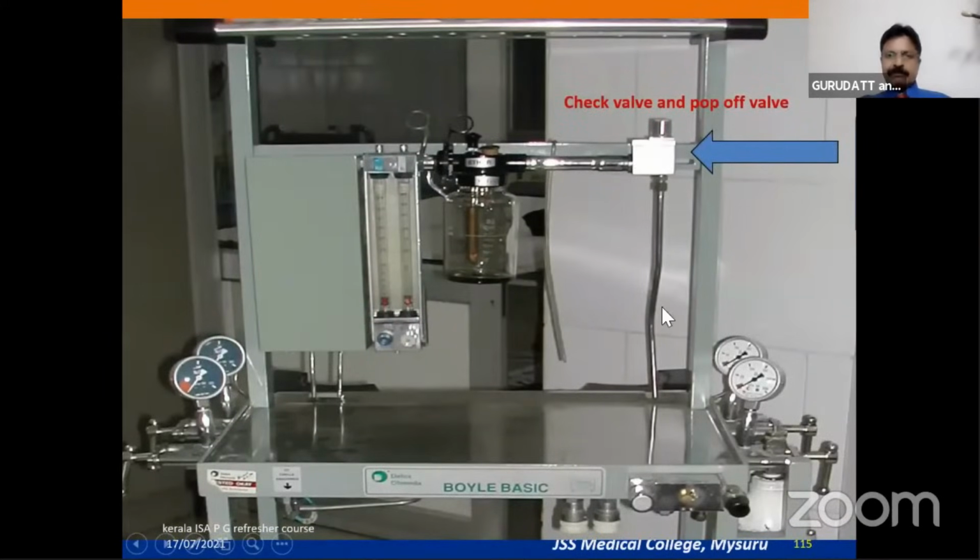Now, in the older machines, you also have a check valve and a pop-off valve. Sometimes you will be asked about this pop-off valve and check valve. So you'll be asked, what is this? So you have to identify this as the check valve and the pop-off valve.